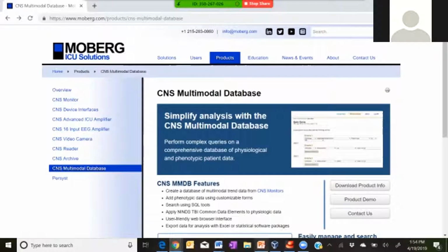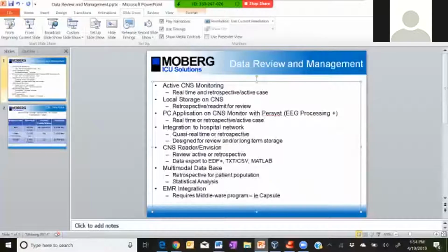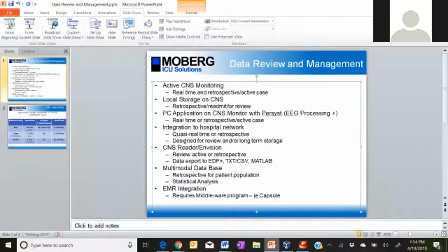So the last thing I want to talk about, and this is a question that Kathy and I get asked all the time, is does the CNS monitor talk to my electronic medical record? And the simple answer is yes, and the complicated answer is also yes.